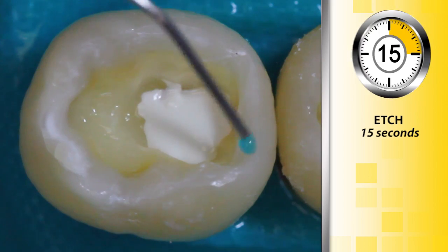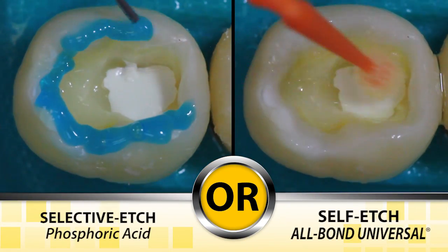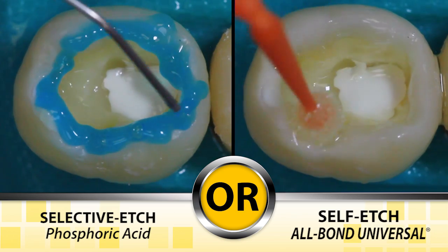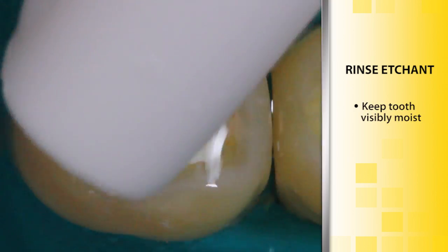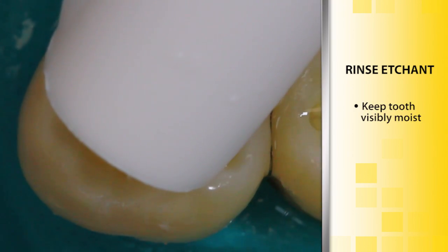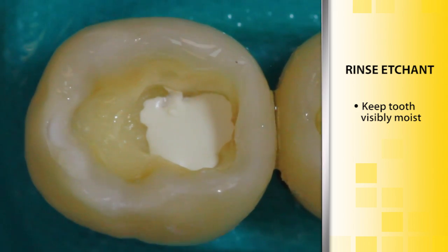Etch enamel for 15 seconds in selective etch mode, or apply All Bond Universal in self-etch mode on enamel and dentin. Phosphoric acid etching should be rinsed off with water and the tooth structure should be visibly moist. High volume evacuation is recommended for this purpose.